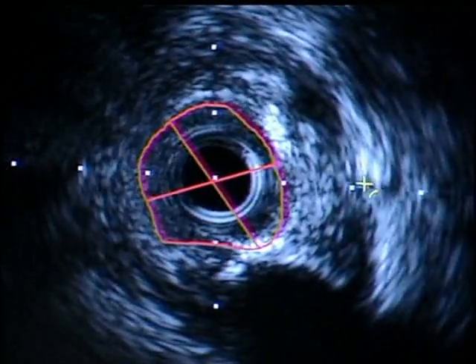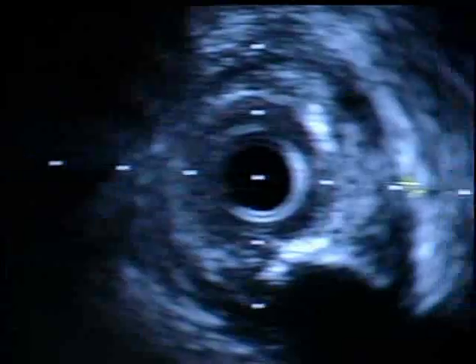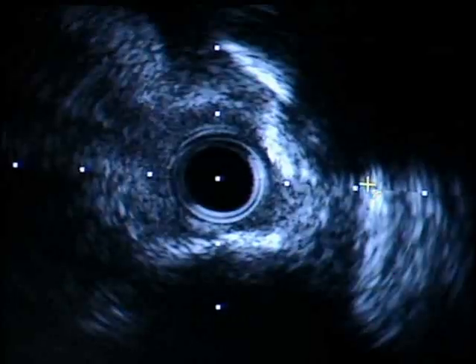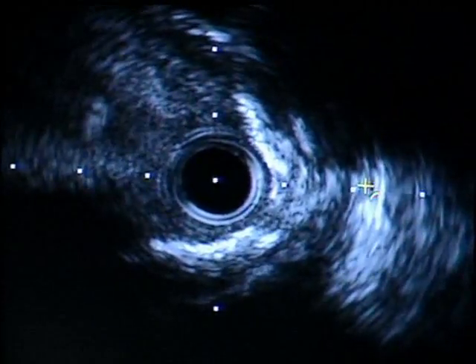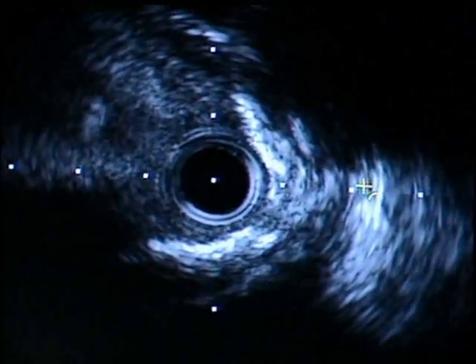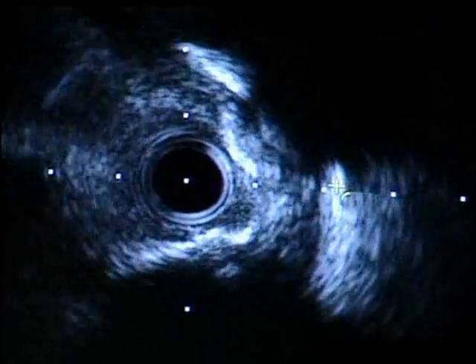Just right there. I think this is the distal left main getting into osteal LAD, exactly where we measured that. We got a 3.1. So, the plan would be to address the distal left main and the ostium of the LAD? Right. Yes, plus take care of that circumflex branch, OM.